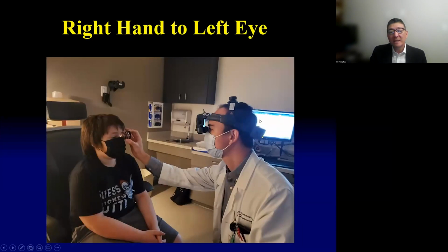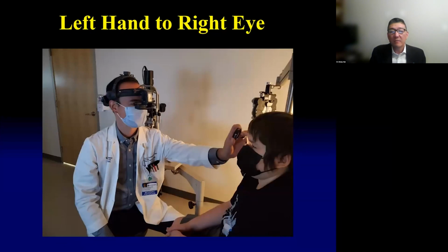This is a resident, Kevin, who's examining the patient here. It's very important for pediatric patients, when you're examining the left eye, use your right hand so that you're out of the way, so that the patient can actually watch the movies or the toys. And when you're examining the right eye, use your left hand so you're out of the way.